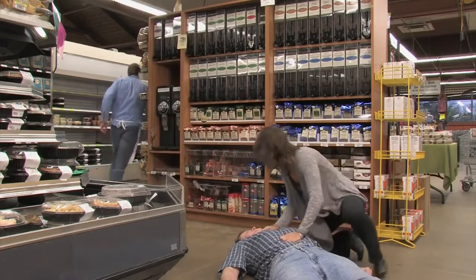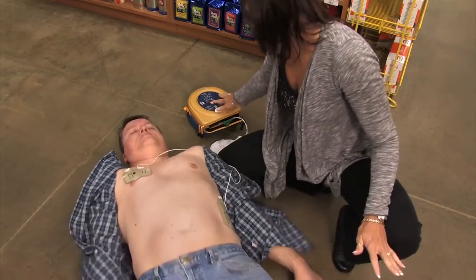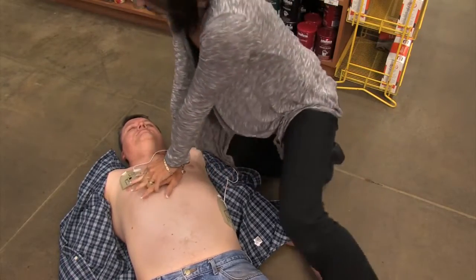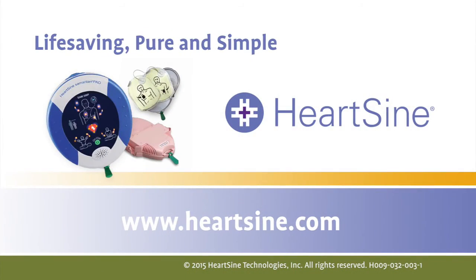With little or no training, rescuers of any skill level can confidently use the HeartSine Samaritan PAD's life-saving technology. With the unit nearby, you are always prepared to respond in the event of someone going into sudden cardiac arrest. HeartSine. Life-saving. Pure and simple.